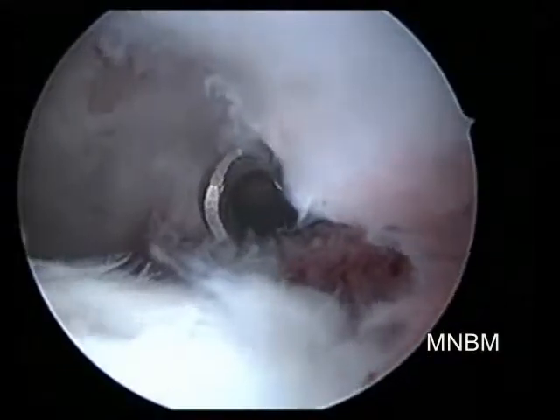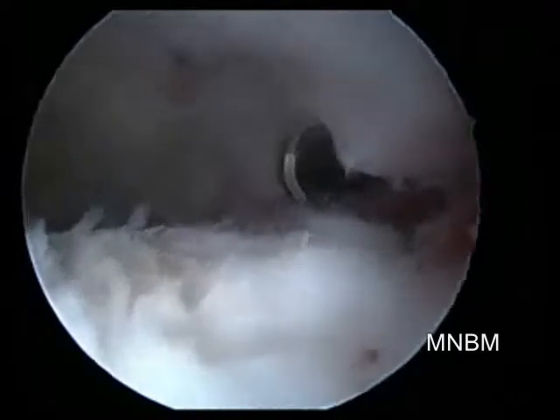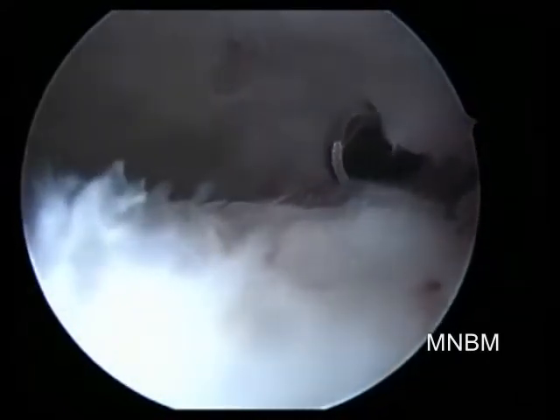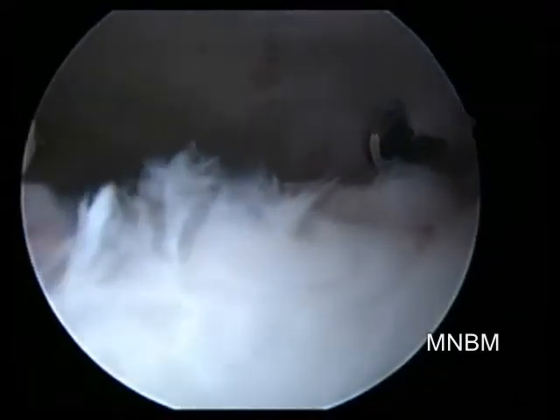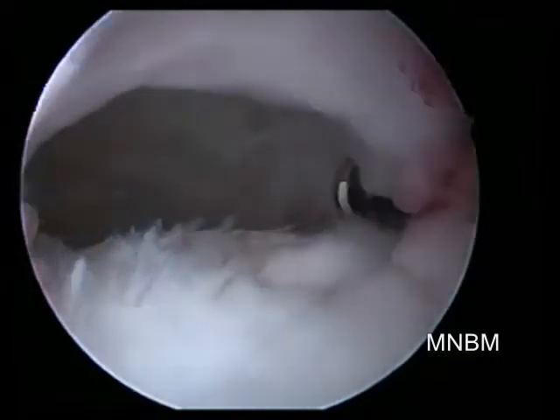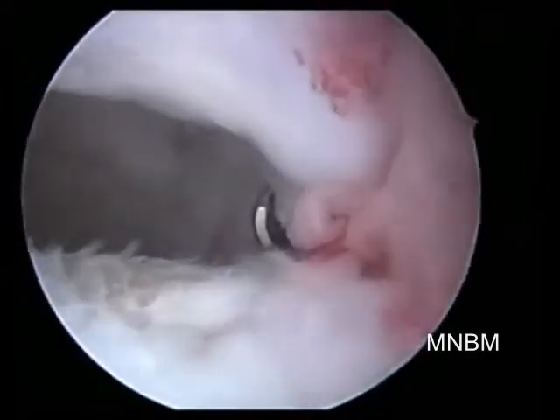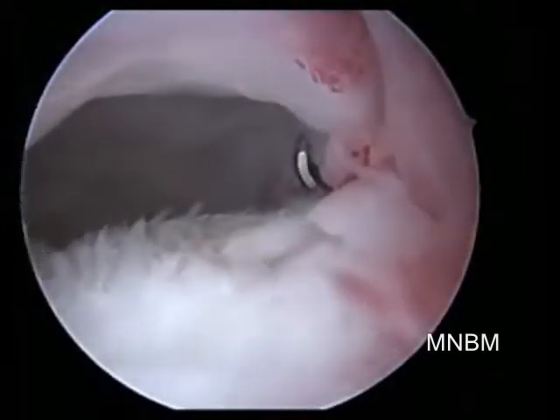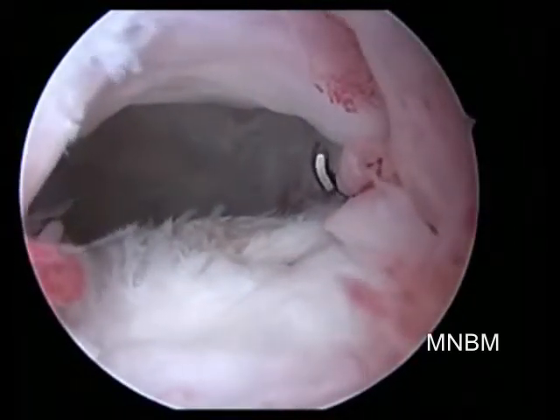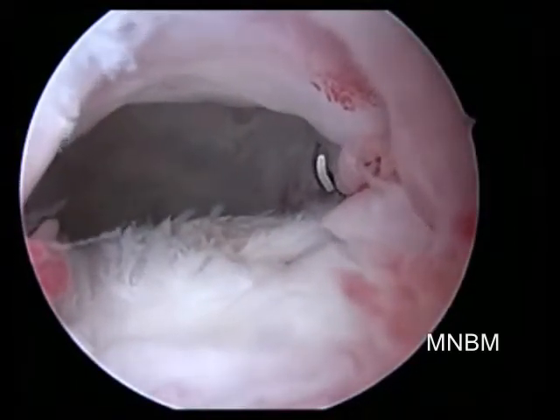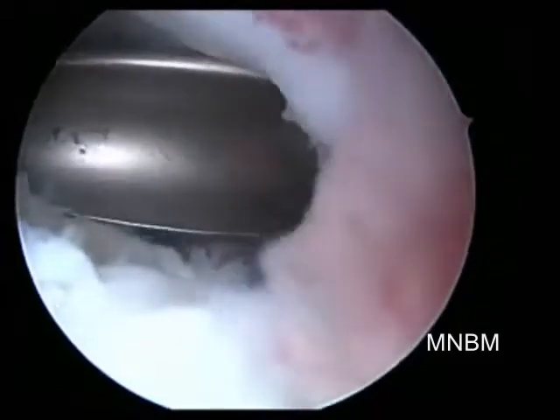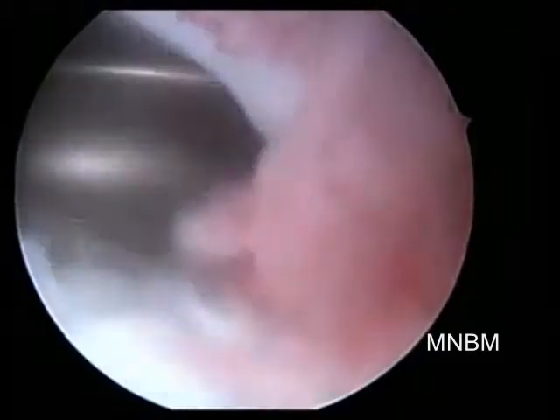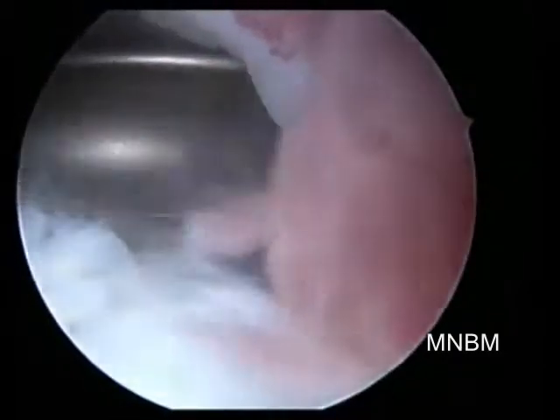The primary viewing portal is the anterosuperior portal and the instrument portal is the anteromedial portal. The hip joint is being viewed from the anterosuperior portal, and the anteromedial portal brings in the half pipe. Following the half pipe, the banana knife comes in, which cuts the anterior capsule and creates an area big enough for instruments to enter.